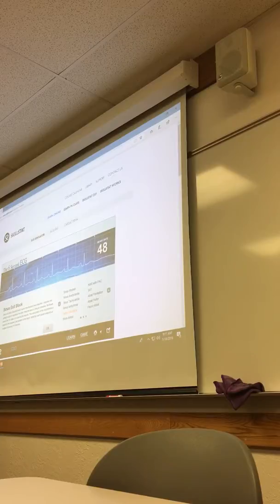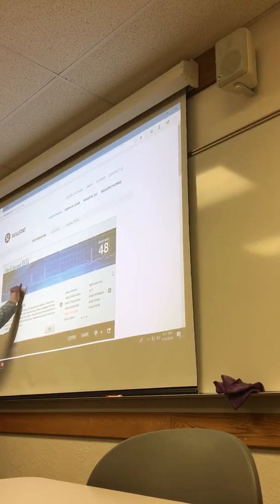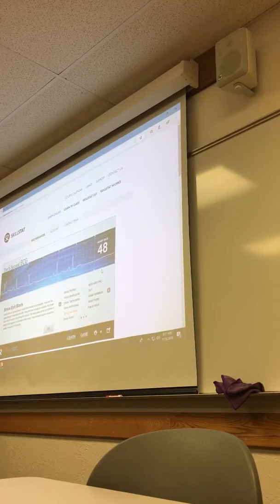Can you see, if we go P waves like this, and we're marching them out, then there should be one here, and then we get right back on time again. So P should have one. If I had my calipers here, one here, we'd be able to tell that it's exactly, if I put it there, it should be, and we would measure that out like that. So it's not like that in sinus arrest.